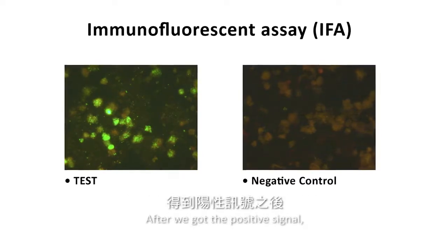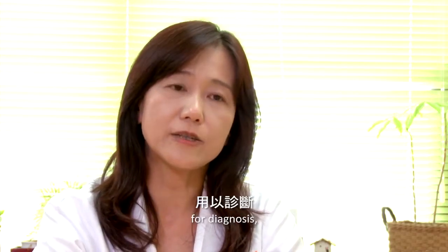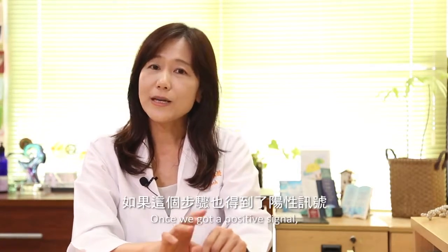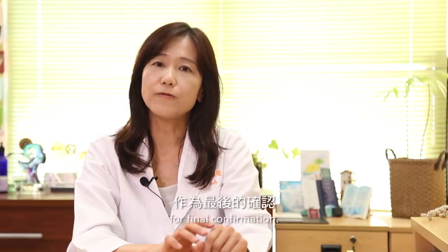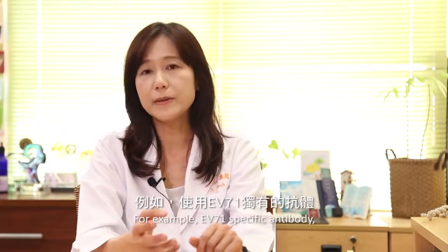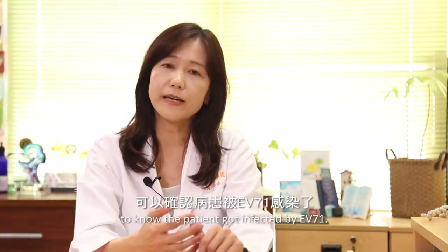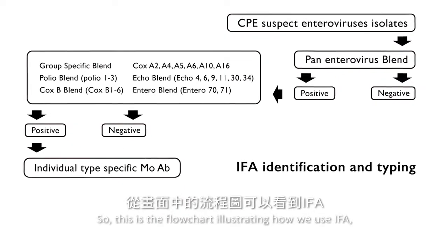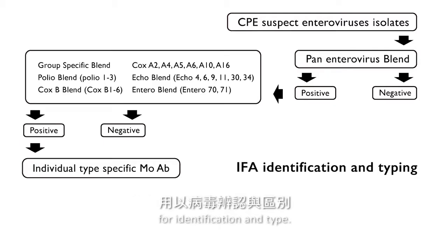After we get the positive signal, we will use the group-specific blend antibody for diagnosis, such as Coxsackie A or Coxsackie B or ECHO or numbered enteroviruses. Once we get a positive signal, then we will use the specific antibody for final confirmation, for example, EV71 specific antibody to know the patient got infected by EV71. So this is the flow chart of how we use IFA, immunofluorescence assay, for identification and typing.